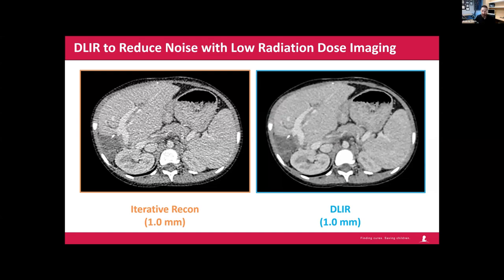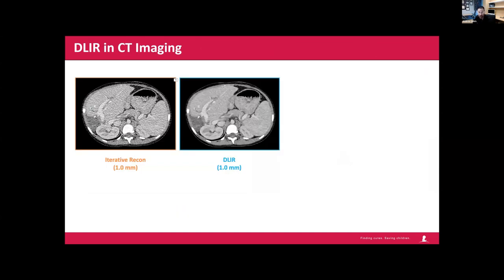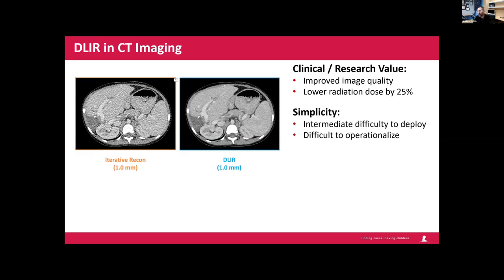So overall, scans is probably a relatively small effect, but I do think that there is a real effect there where you can see things better and reduce potentially diagnostic errors. So the clinical or research value is improved image quality, perhaps improvement in detection of findings by a smidge, and lower radiation dose, which really matters. In pediatrics, it's about 4 or 5 times the risk of radiation causing a downstream event like a cancer or something like that, particularly if they're going to get repeat CT scans.